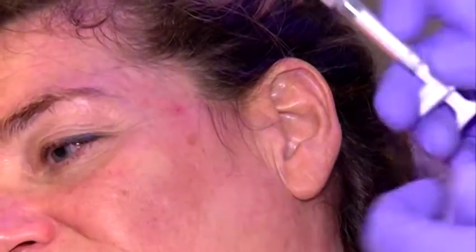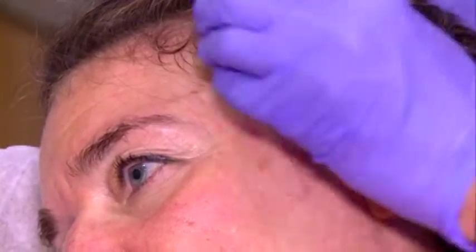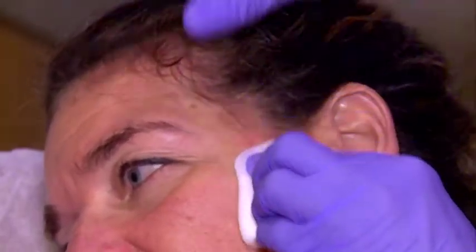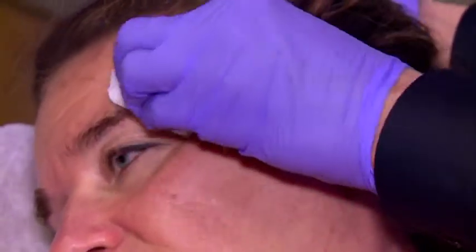But this goes away in the next, okay? So you see, can you see this in the video? You see the irregularities? I have to put back, yeah, it's not so much. Can you see these irregularities here? Okay. And I massage it away. Very easy. And then for a week after the treatment, is there any advice you want to give to the patient, or just carry on, have fun?